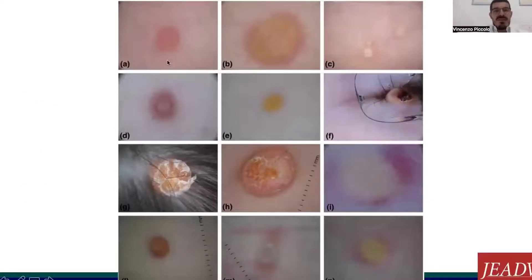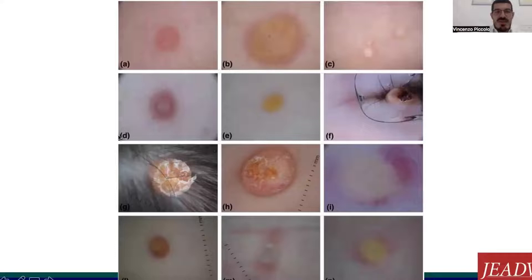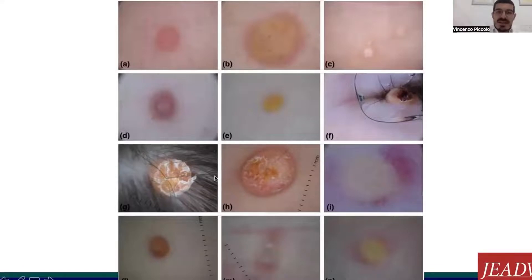This is a comparative picture of a series of cases. As you can see, the yellowish-orange background is well represented in many tumors. Most lesions are symmetric in shape and in their dermoscopic features. We have various vessel types visible here — dotted vessels, glomerular vessels, linear vessels. This is the typical setting sun appearance. In the case labeled N, we also have scales, rosettes, whitish streaks, and ulceration. There is a large variability of dermoscopic appearances across these cases.